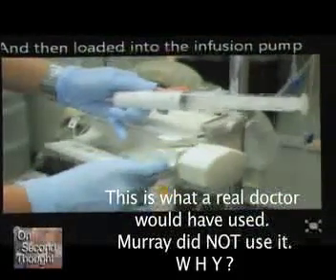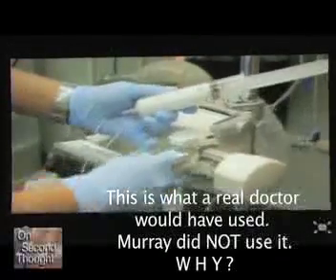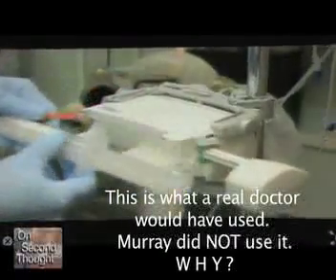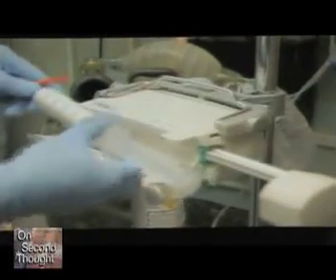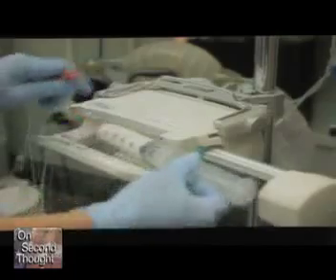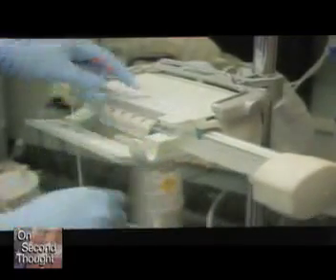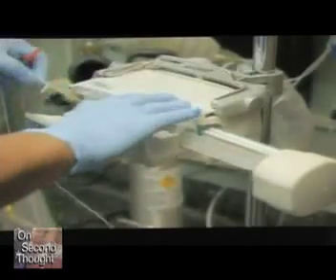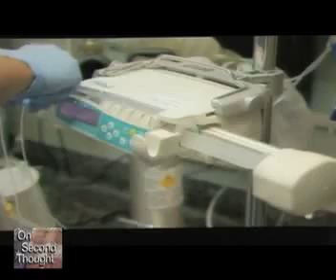So this is a syringe pump. As you see the pump, that piece that's moving back is what is going to push the syringe forward in just a few moments. The syringe is placed into the pump. It is locked into place, shown here so that it can't move. And then the tubing is brought forward.